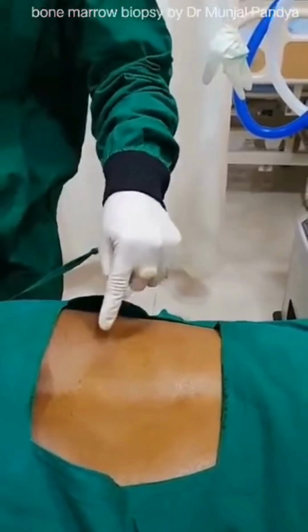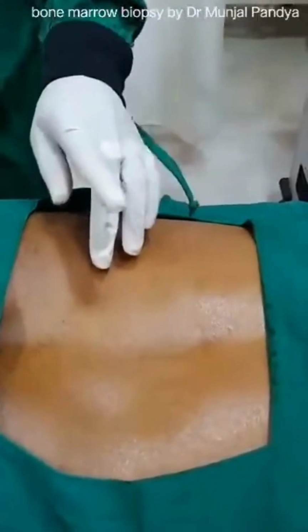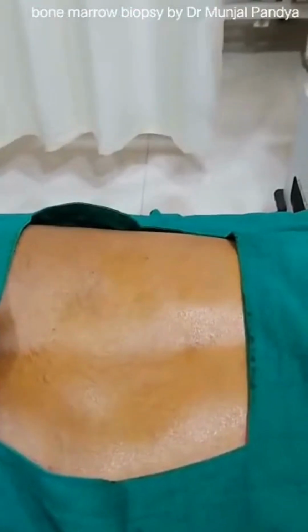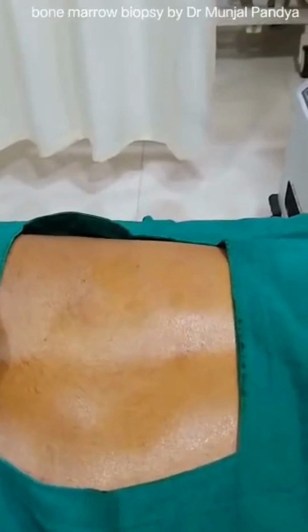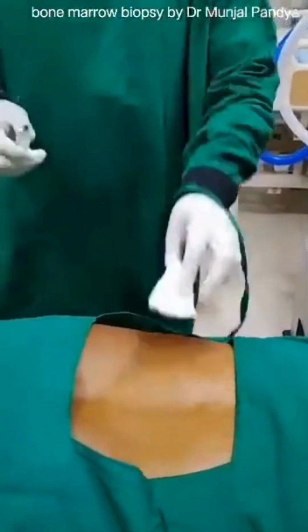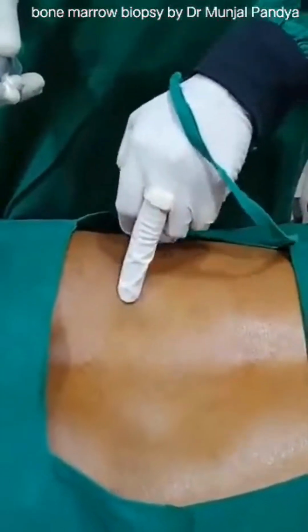If you can see here, this is ideally the posterior superior iliac spine. The general marker of the posterior superior iliac spine is the deepest part just above the buttocks. You can feel the posterior iliac spine as the most prominent part. So now after painting and draping, this is the posterior superior iliac spine.